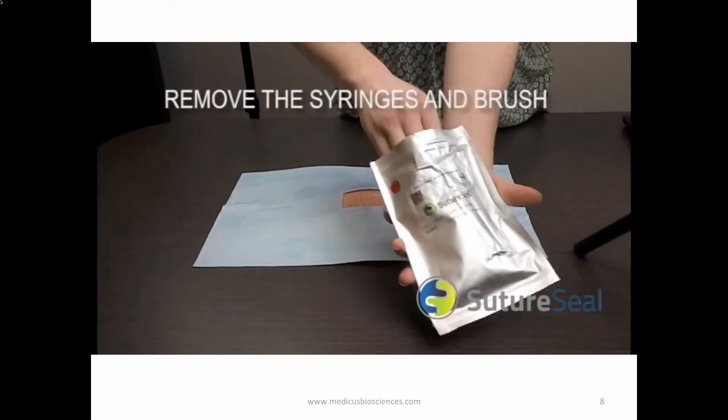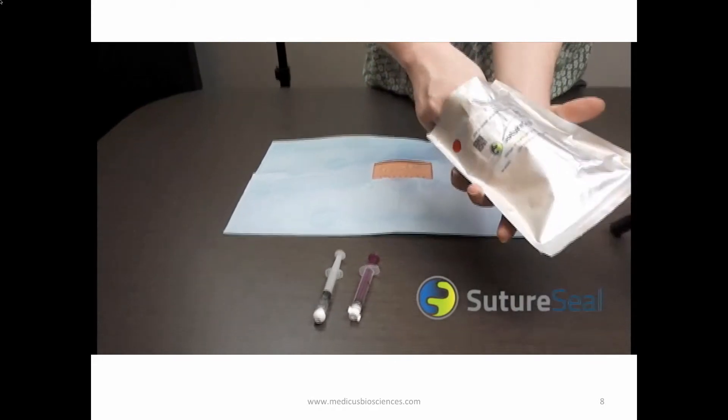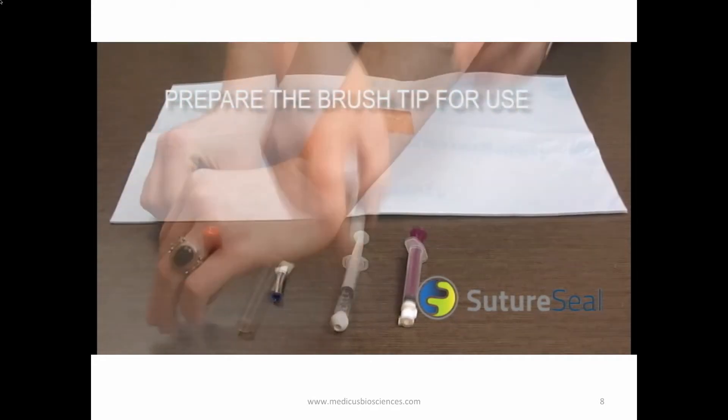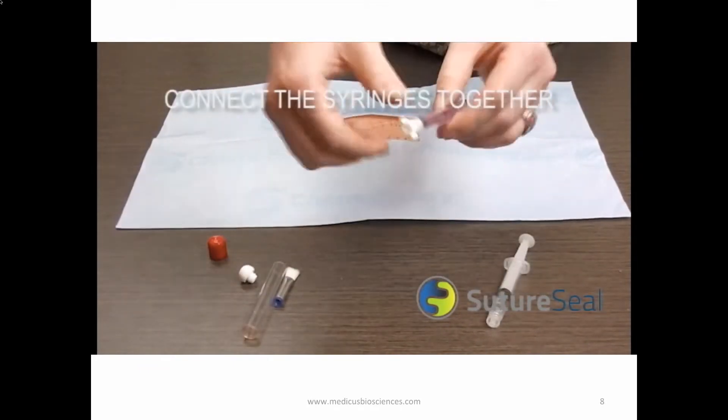Open the foil pouch and remove the two syringes and the application brush tip. Remove the sterile application brush from the brush case and have it ready for use. Remove the caps from the two syringes and connect them together.